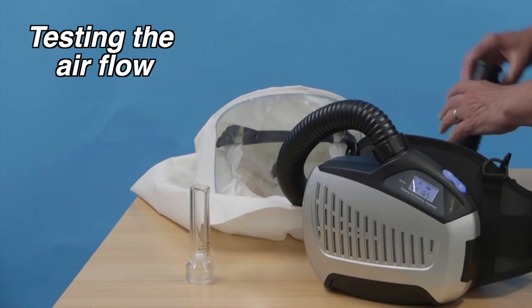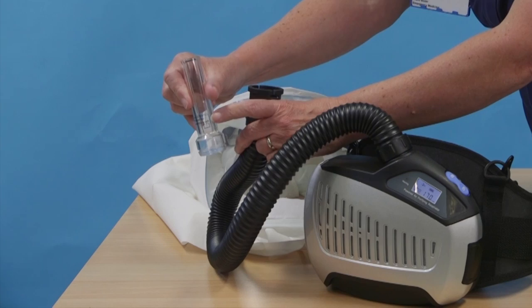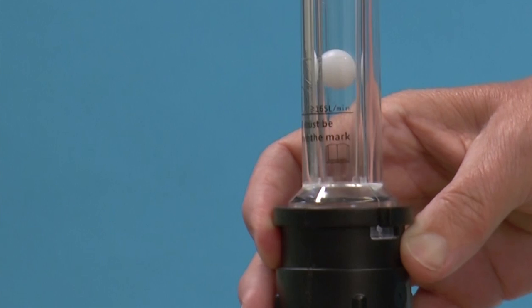Before each use, the airflow must be tested. Switch on the respirator and allow it to reach 170 litres per minute. Insert the flow meter at the top of the tube and hold it in a vertical position. The airflow is sufficient if the marble reaches the minimum flow level.